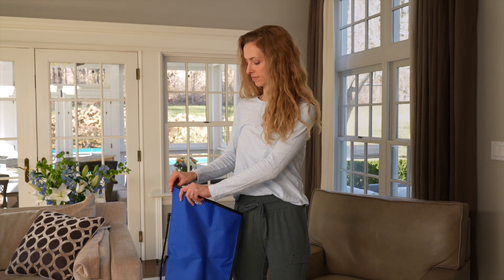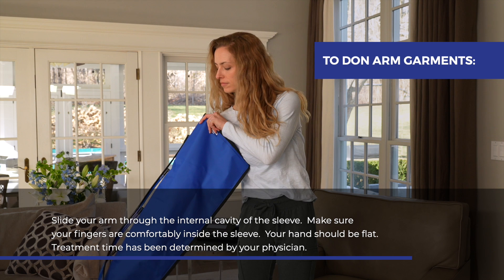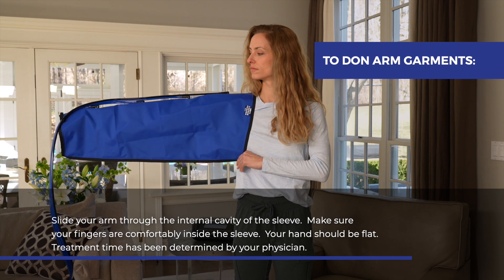To don arm garments, slide your arm through the internal cavity of the sleeve. Make sure that your fingers are comfortably inside the sleeve. Your hand should be flat.